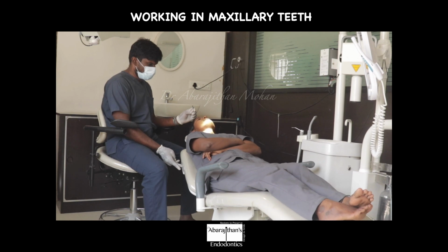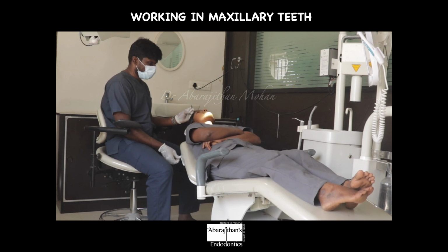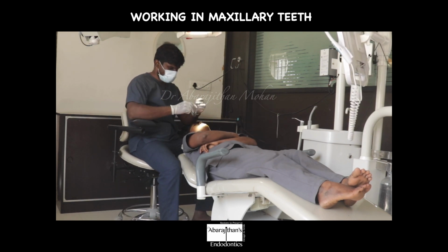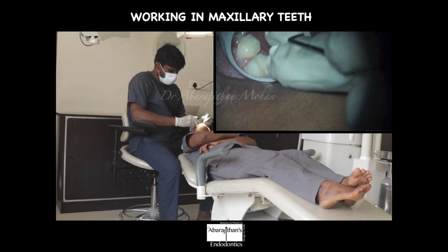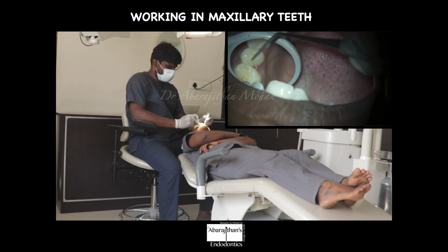So this is how we are going to work on the maxillary teeth. You can see I need to increase the chair height a little before I make the patient go into the supine position. And the operator slightly moves from a 10 to 11 o'clock position or even a 12 o'clock position for maxillary teeth, whereas it was a 9 to 10 o'clock position for mandibular teeth.